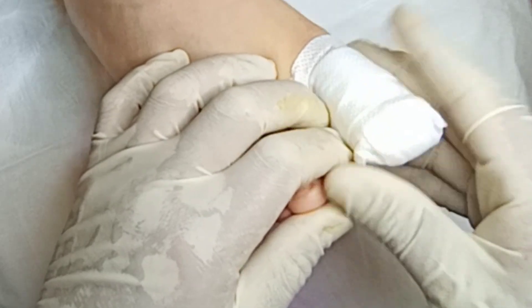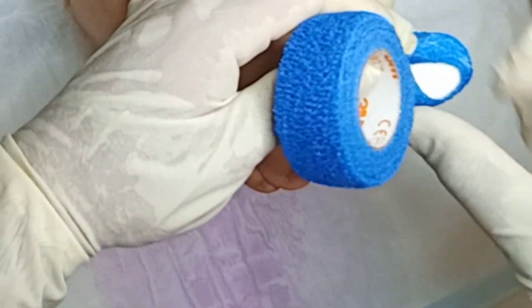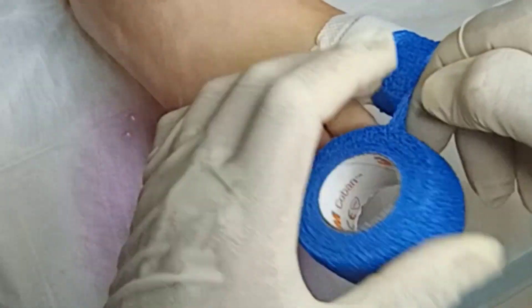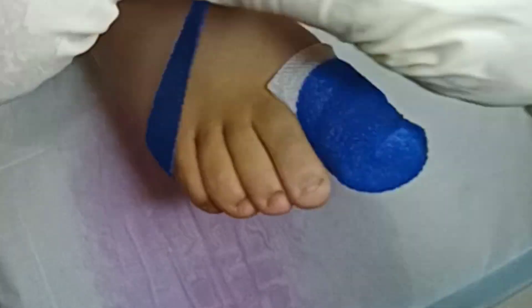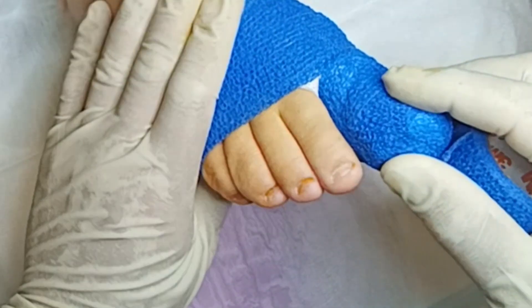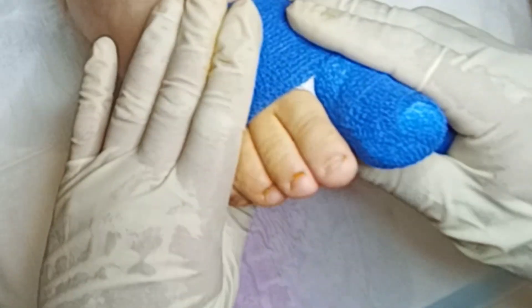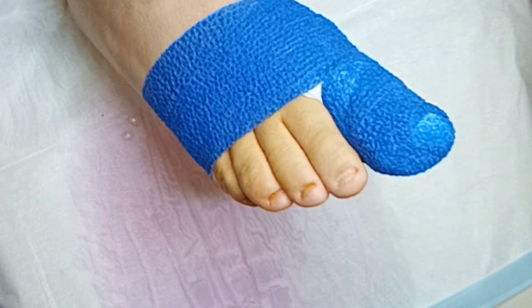Presentation is very, very important — patients are going to look at it and other people are going to look at it. I'll put one more towards the base to hold everything down. This is where the co-band comes in — people wear thongs and shoes, and this dressing can sometimes peel at the base. We don't need to use a sterile field now since we've got a sterile dressing on there. We wrap around the toe — this is a stretching material they use a lot in pediatrics. It will not constrict blood circulation. I'll go around the toe and then around the foot too to help secure the dressing. I choose the color blue to signal to people: 'My toe — something's going on, I just had a procedure, be careful, don't step on it.'